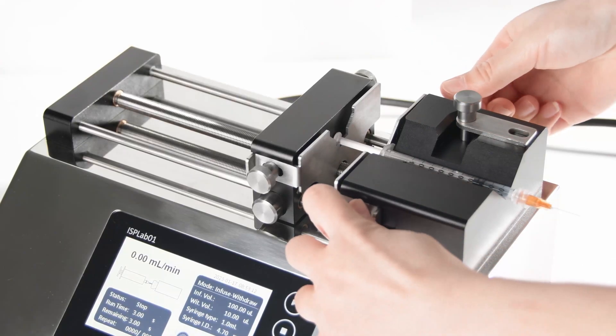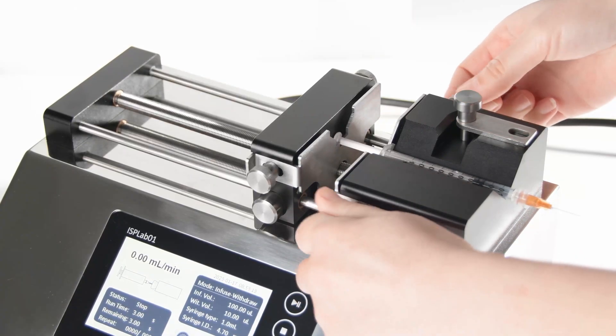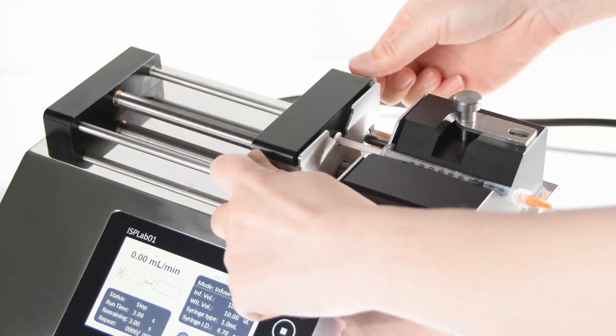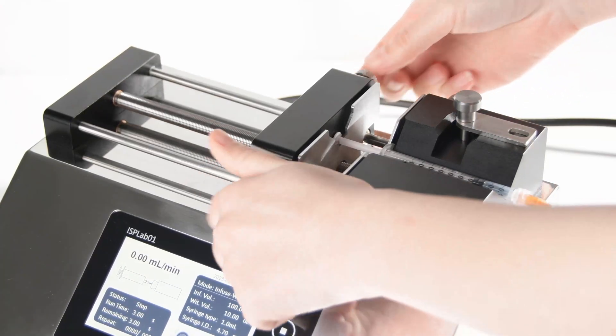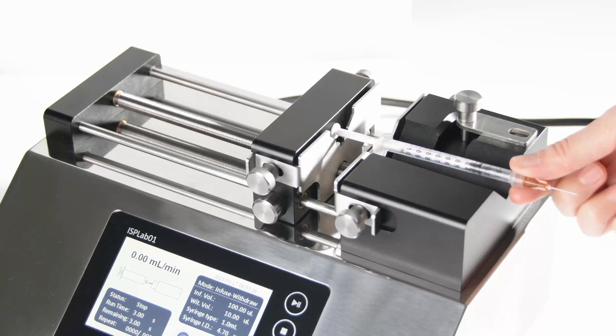Traditional syringe pump? Need to change syringes so it cannot achieve uninterrupted transferring.